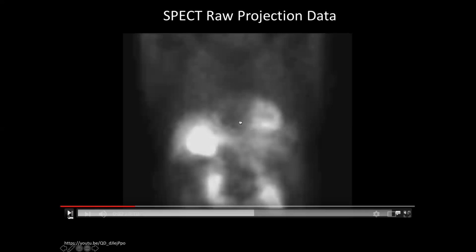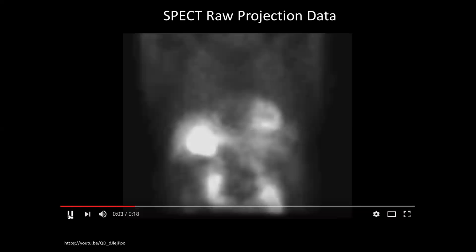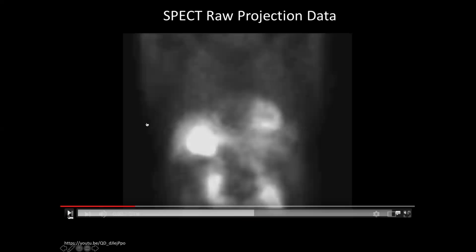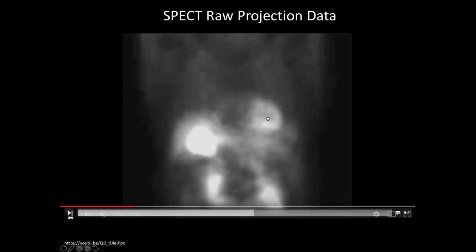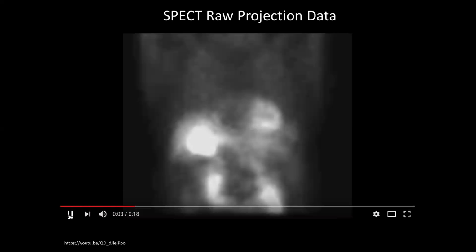So all of the reconstruction we're going to do in 3D for when we're talking about this is assuming that we're extracting out the projections for a specific slice, and we'll do our two-dimensional reconstruction of that slice independent of what's going on up here and down here. We're just going to look at that slice. Okay, so it's going to be 2D reconstruction.